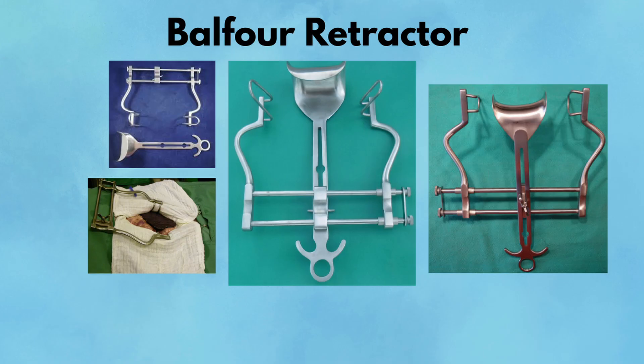You'll most commonly encounter the Balfour during exploratory laparotomies, bowel resections, trauma cases, or oncologic surgeries where maximal exposure is essential. Pearl: adjust the lateral blade sizes and central blade angle to tailor exposure — a small change in blade tension can significantly improve visibility. Pitfall: overcranking can injure the abdominal wall or cause pressure injuries, especially in thin patients or prolonged cases. Always release slowly at the end of the case.